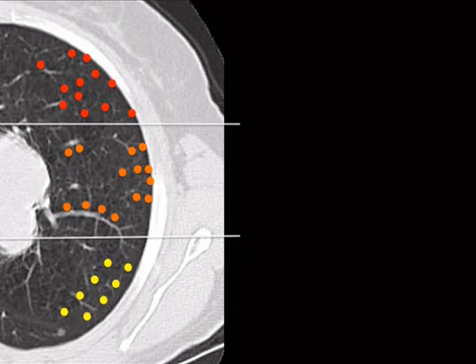Or you could just ask, what pattern of nodules is this? And that way you would have to be able to differentiate between them. So let's do that first.